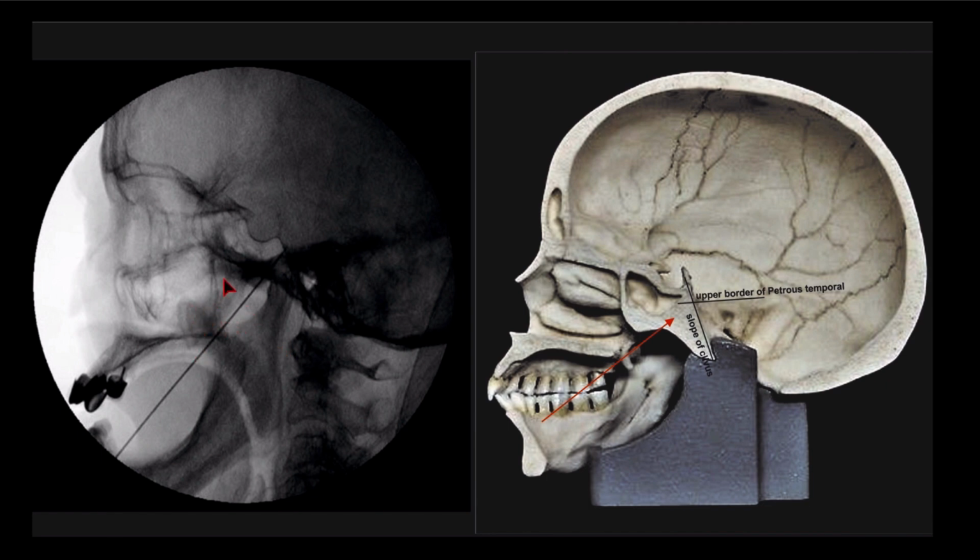So actually the sphenopalatine ganglion block cannot be done in the tunnel view because this coronoid process is almost at the same level. That's why we are taking as anterior as possible in the mandibular notch and entering into the pterygopalatine fissure. Or better, you see the pterygomaxillary fissure and try to enter it. Anyway, that is the other block.